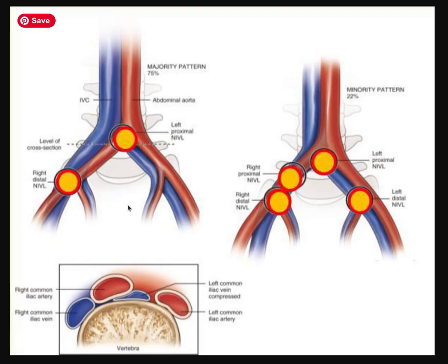May-Thurner physiology refers to the compression point right here. This is where the right common iliac artery compresses the left common iliac vein against the L5-L4 vertebra — it squeezes it like a pancake. Depending upon how your vasculature is set up and if you have other predisposing conditions, there can be extra compressions in this area.